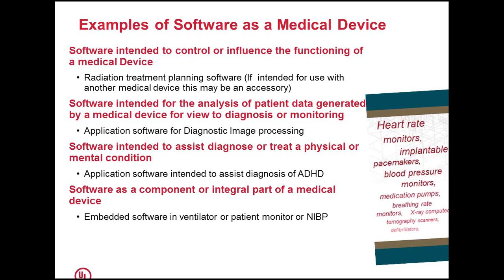Then you have a software which is a component or an integral part of the device. This is where the embedded software goes inside to control plenty of medical devices which are there in the market. Some examples: patient monitors, ECGs, BP apparatus, ventilators, X-ray machines, MRIs. All of these medical devices contain this embedded software to control the functionality and the performance of the device.